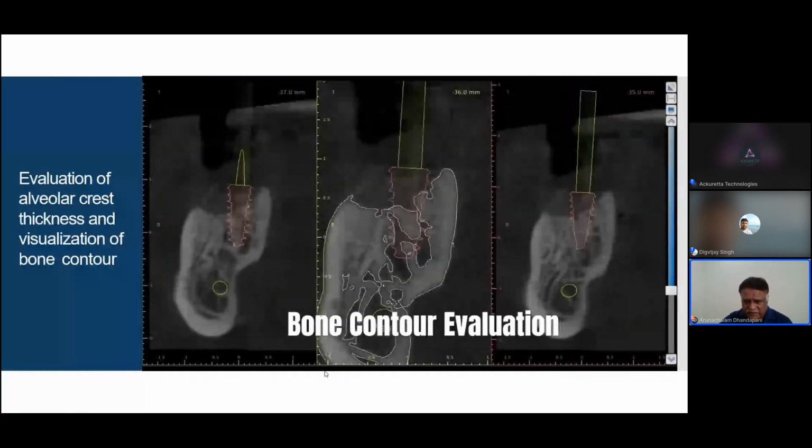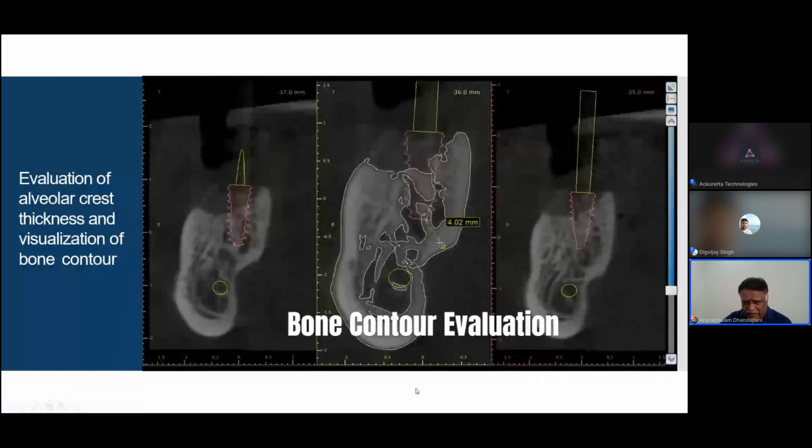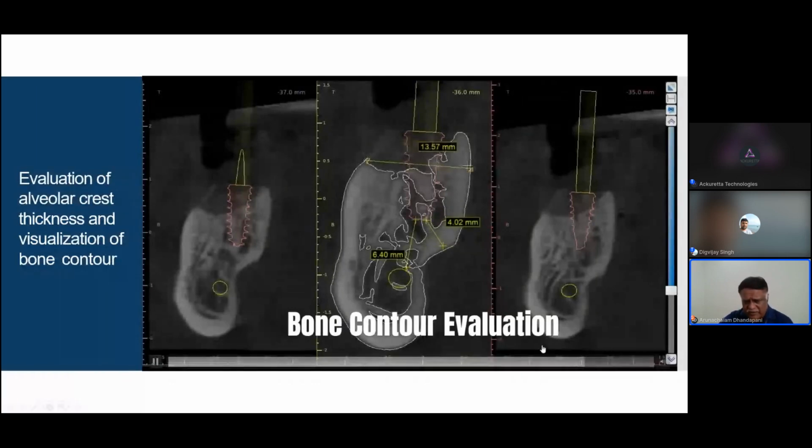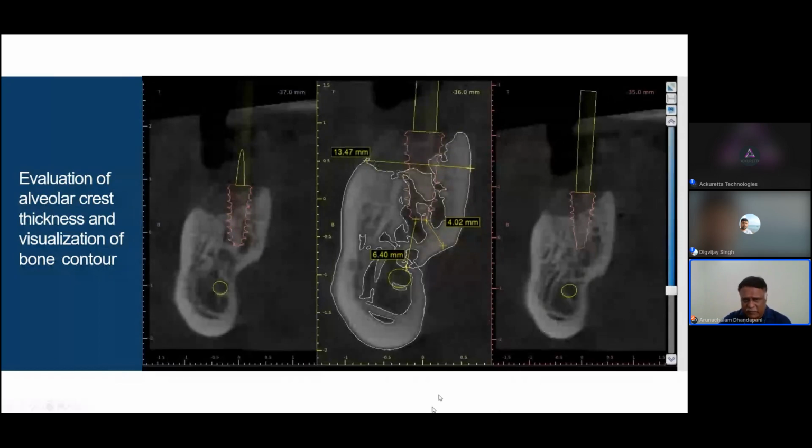And you see here in this segmented model, we are able to look at which are the areas of the bone that have an optimal density, what are the distances to the nearest large cancellous spaces, and so forth. So there is an elaborate understanding of what kind of tissue, what is the quality and quantity of tissue that we're dealing with.